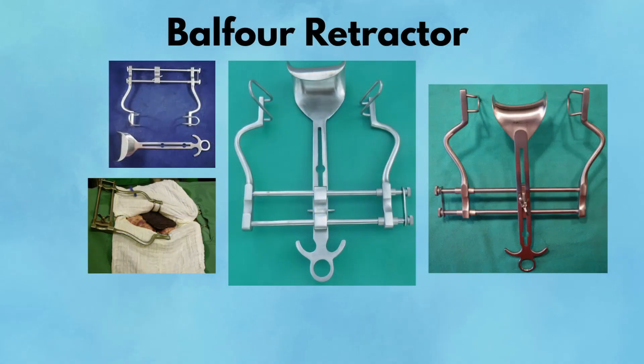Balfour Retractor. The Balfour Retractor is a heavyweight champion in abdominal surgery. It's a self-retaining stainless steel retractor designed to hold the abdominal cavity wide open during midline laparotomies. The standard Balfour includes two lateral blades and a central detachable bladder blade. When properly assembled and positioned, it retracts the rectus muscles laterally and the bladder or bowel inferiorly, creating a clear, stable view of the entire intra-abdominal field. Once placed, the ratcheting mechanism locks everything in position, freeing the surgeon and assistants from manually holding retractors — a huge ergonomic advantage during long procedures.